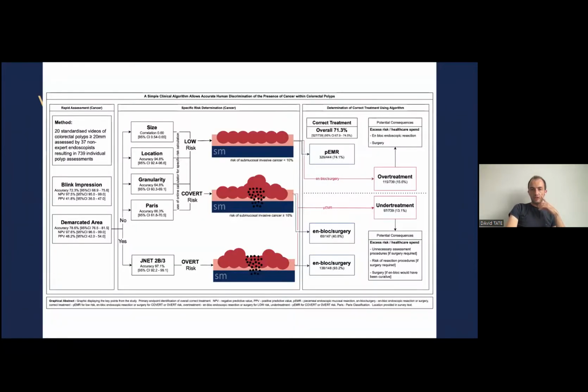All right. So then we might say, well, how do we assess such polyps? Well, actually, if you find a demarcated area, then you go down the route we've just described and you look at the demarcated area. But if you don't find a demarcated area, then we are talking about, is there still a risk of cancer within this polyp? And there is still a risk of cancer within polyps which don't contain a demarcated area.